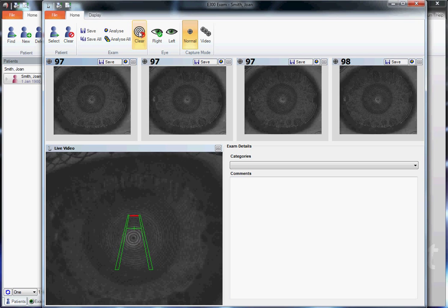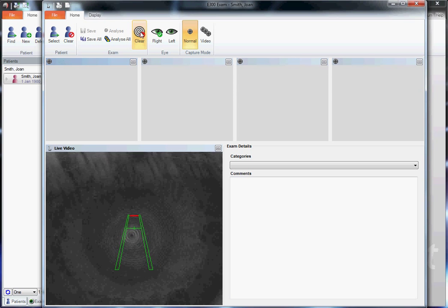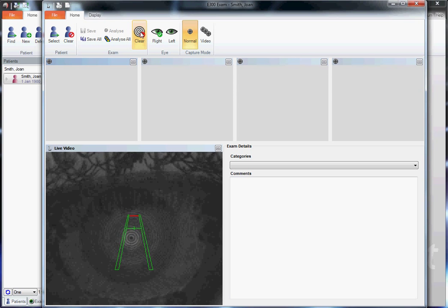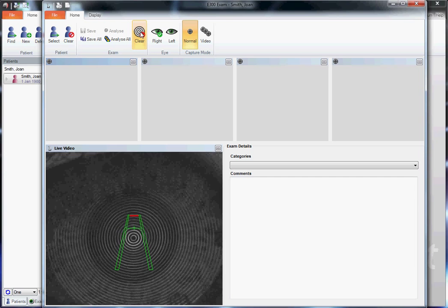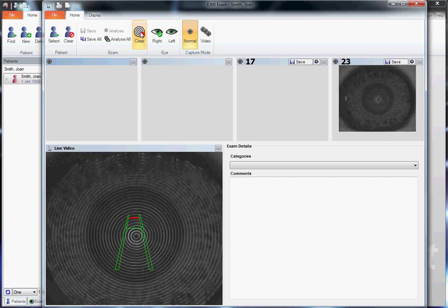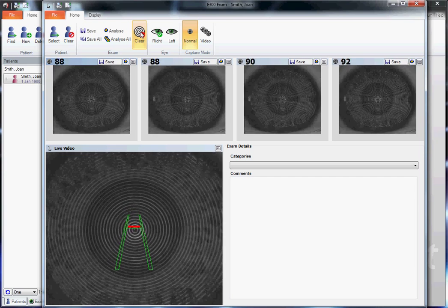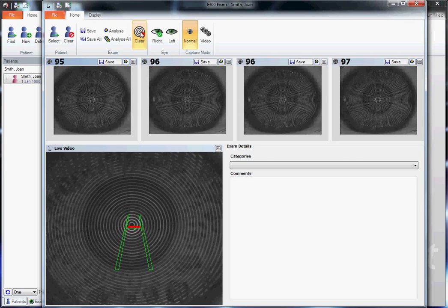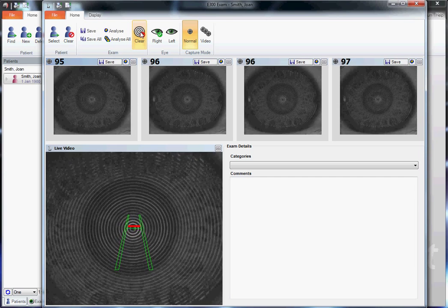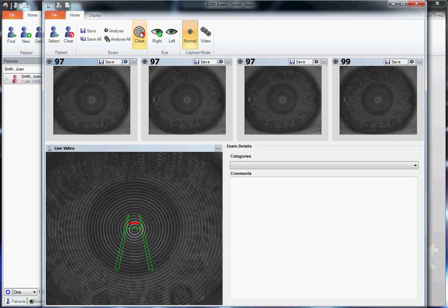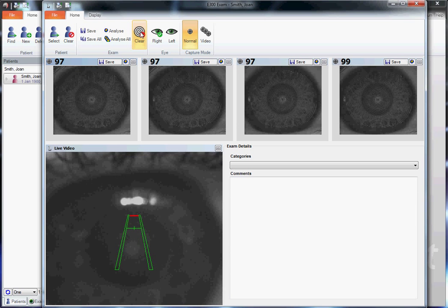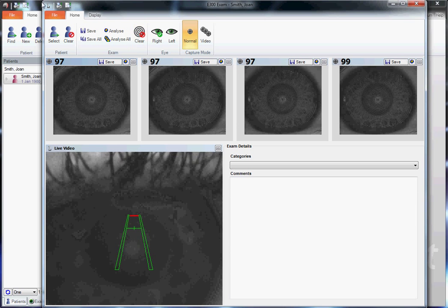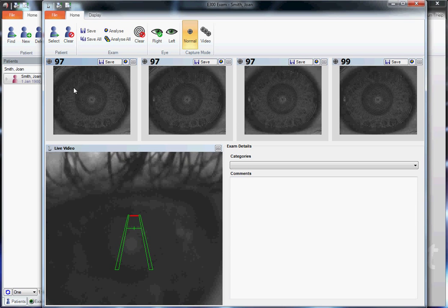Let's click clear images, ask the patient to blink, open up as wide as possible, and take our image above 95% all the way across the top of the window.